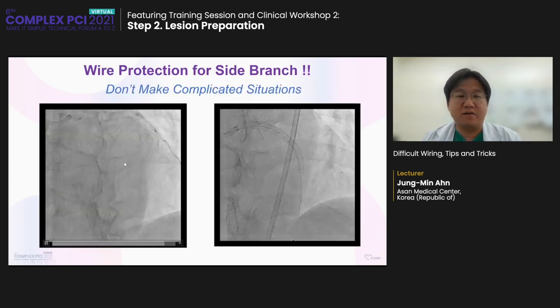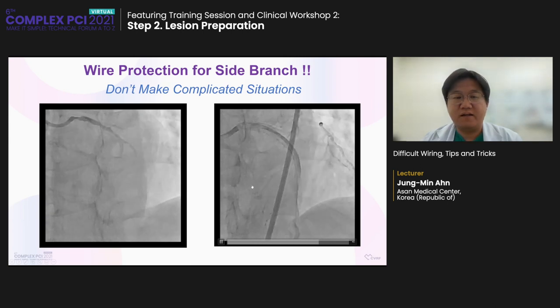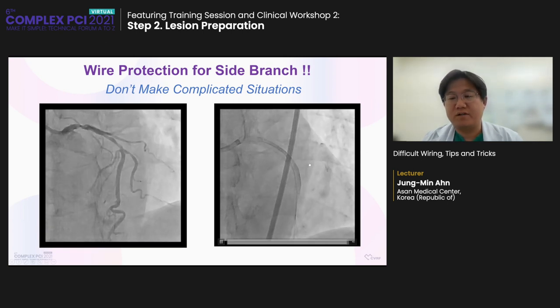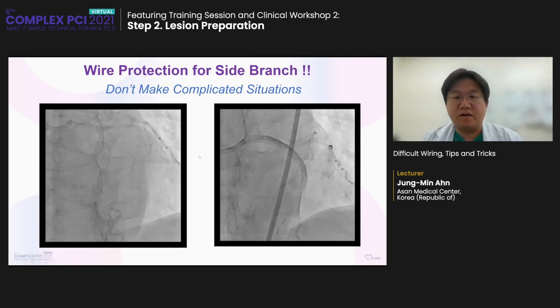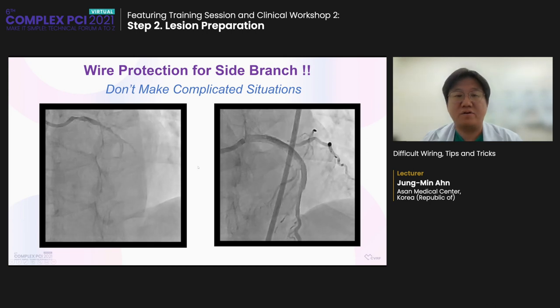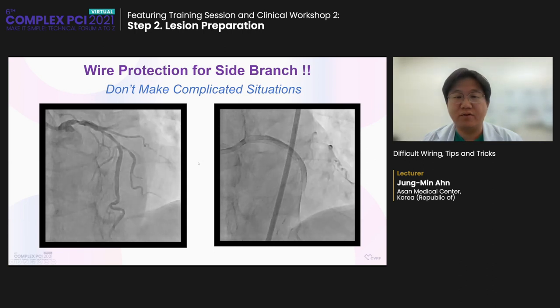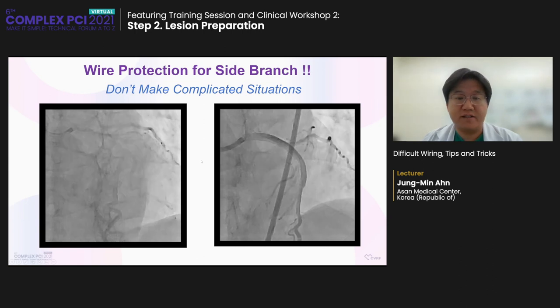Another situation, I did a simple crossover stenting without side branch jailed wire. Side branch gone. So I think jailed wire technique for simple crossover stenting is very important. So first important message is don't make a complicated situation. Please insert the wire to the bifurcation side branch.